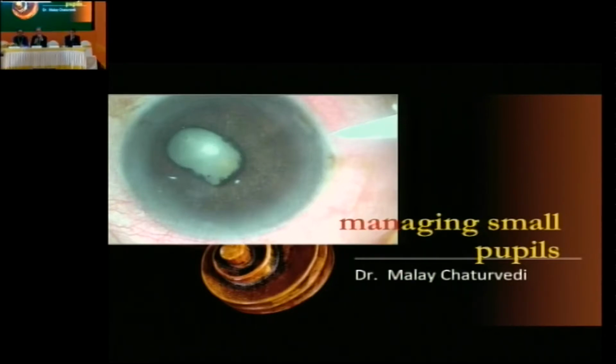And so that is the best technique what Dr. Vinod has explained: do either hydroflip or the viscoflip, where you take out the whole cataractous complex into the anterior chamber or onto the anterior capsular surface, and then very slowly you start aspirating. But many times with these soft cataracts you may come across a little bit of brittleness.